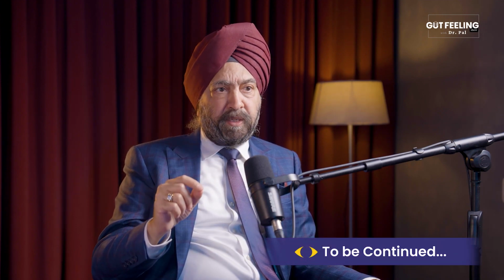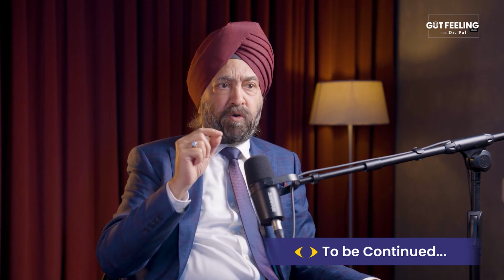Patient comes to us wanting to eliminate glasses. We never promise eliminating glasses post-operatively. We just say it will reduce your dependence on glasses for all distances.